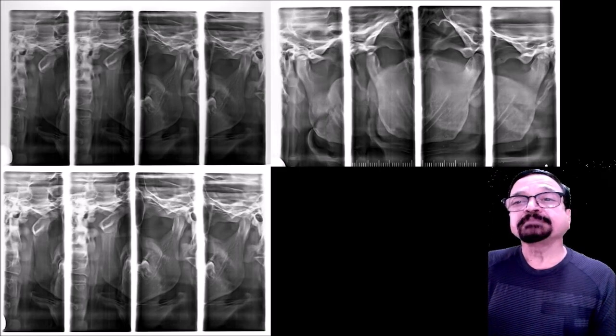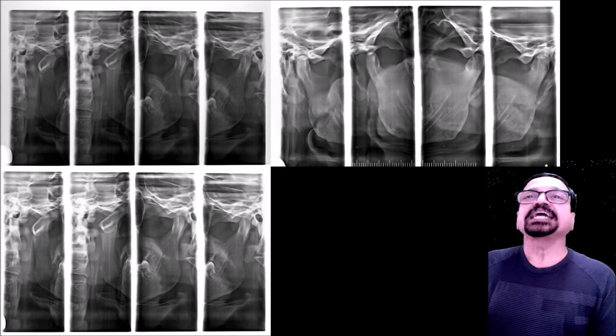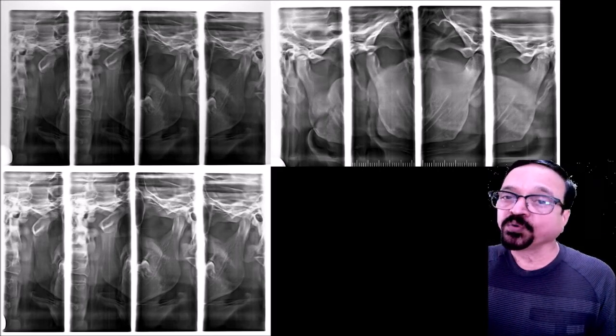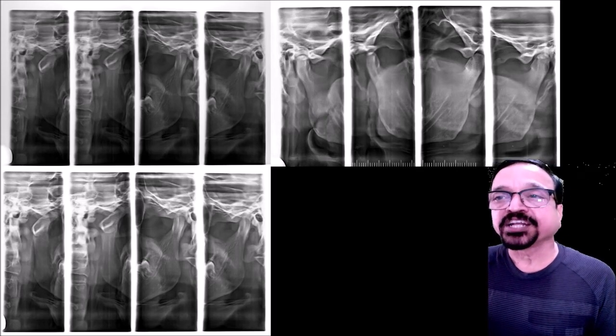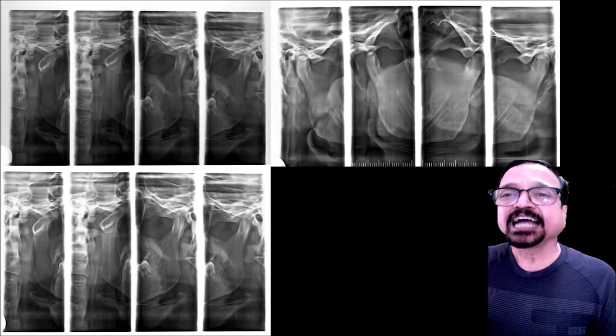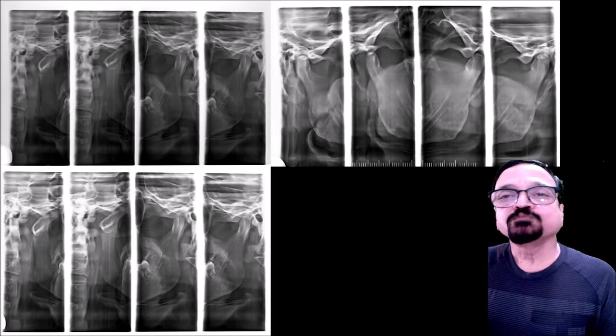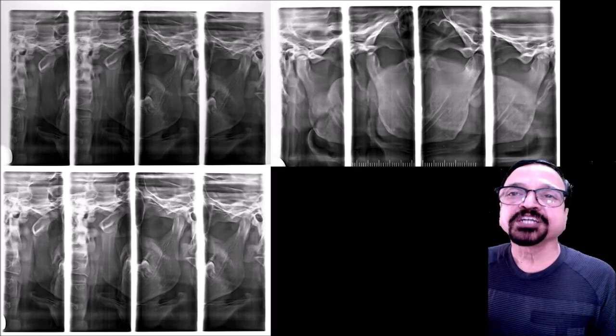Third is the entire mandible is never exposed to radiation. So it is radiation saving. Though we are taking 4 radiographs, there is no 4-time radiation. It is only as much as a single time rotation. So it's excellent as far as TM joints are concerned because it gives you cervical spine free TM joints. There is no overlapping of cervical spine, one, and second, most important, dynamic positions of the TM joint condyle are possible in this view.